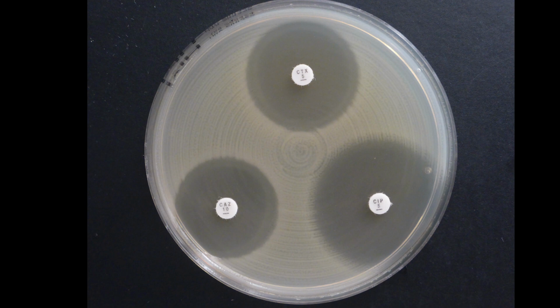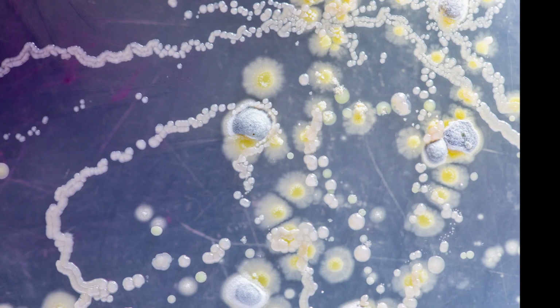This is an example of a plate where we have actually taken care to streak the plate carefully, but you still see the patterns from streaking the plate. That's more or less impossible not to do. But these examples could also have been much worse if plates weren't streaked that well. So that could be discussed in the group.